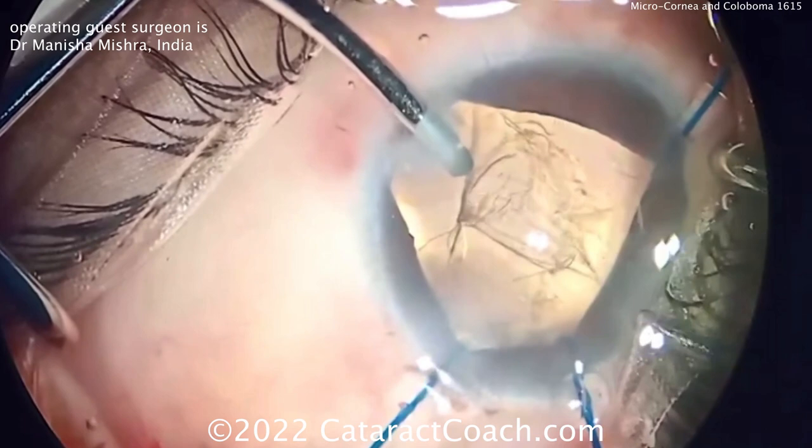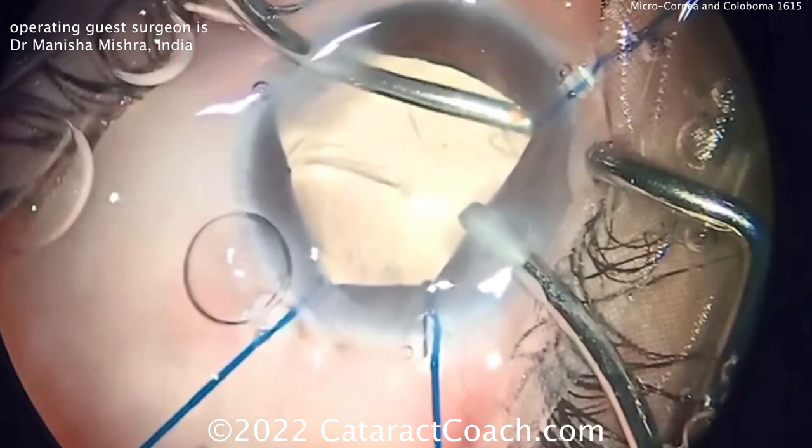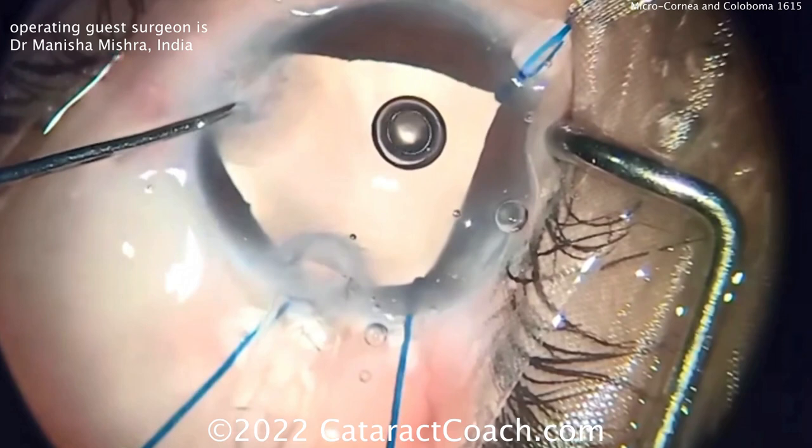Cortex removal — remember this is a little more challenging on the cortex removal. You have to go a little more tangential and circumferential because the patient has a capsular tension ring in place, and that can hold some of the cortex up against the capsular bag equator. Just take your time here — a manual approach is a great choice.